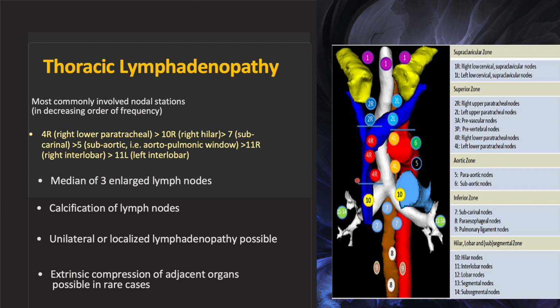Most commonly when we perform an endobronchial ultrasound, we're able to sample the 4R and the 7 stations with ease, and once we go ahead and sample the 11 or 10 lymph nodes, we can have more diagnosis, but 4R and 7 usually clinch the diagnosis in a lot of patients.